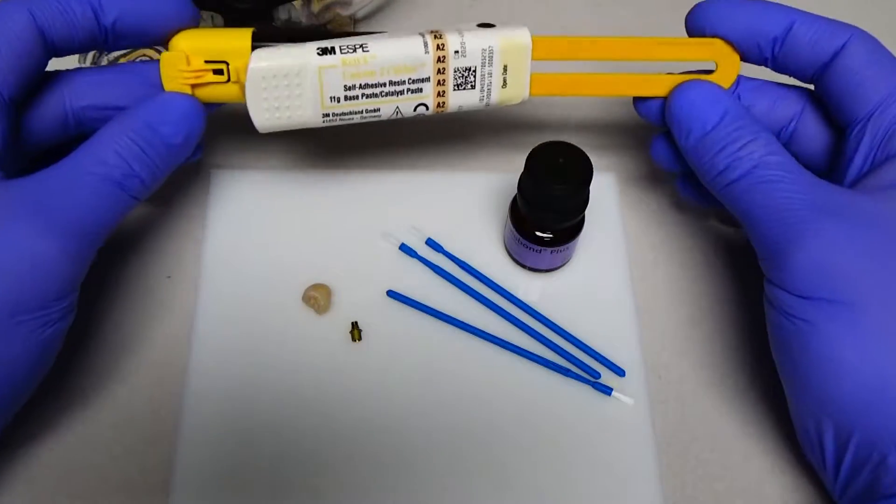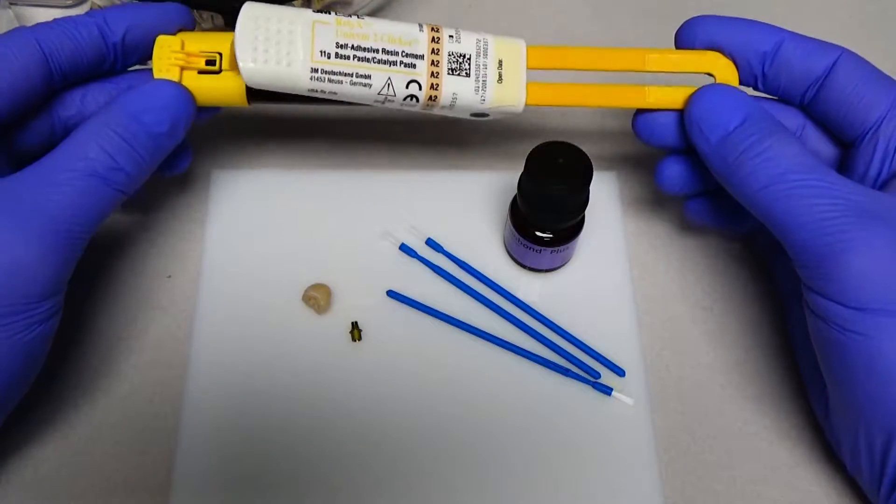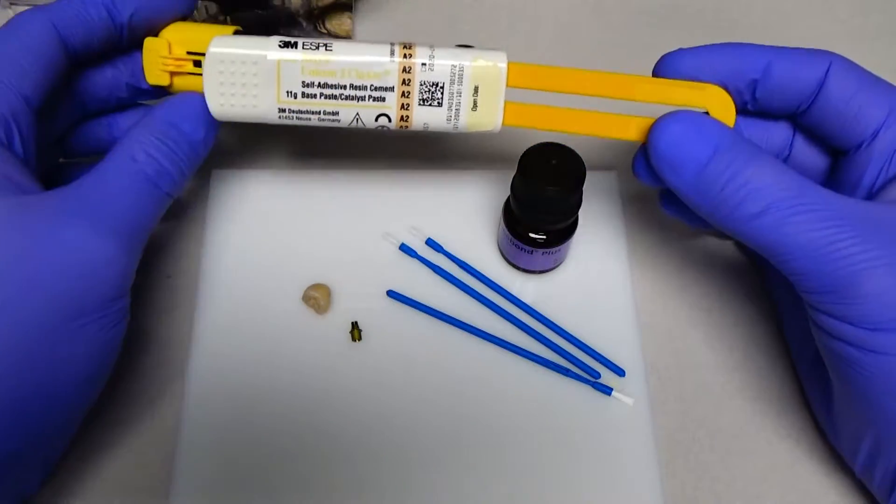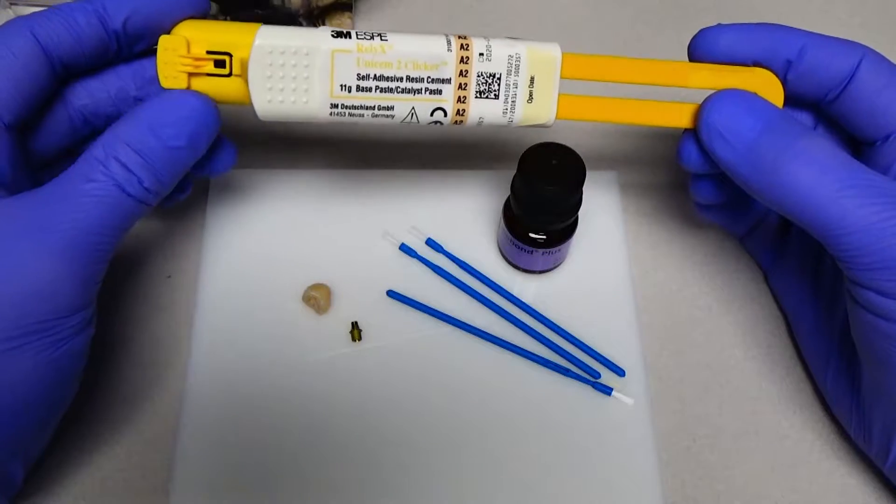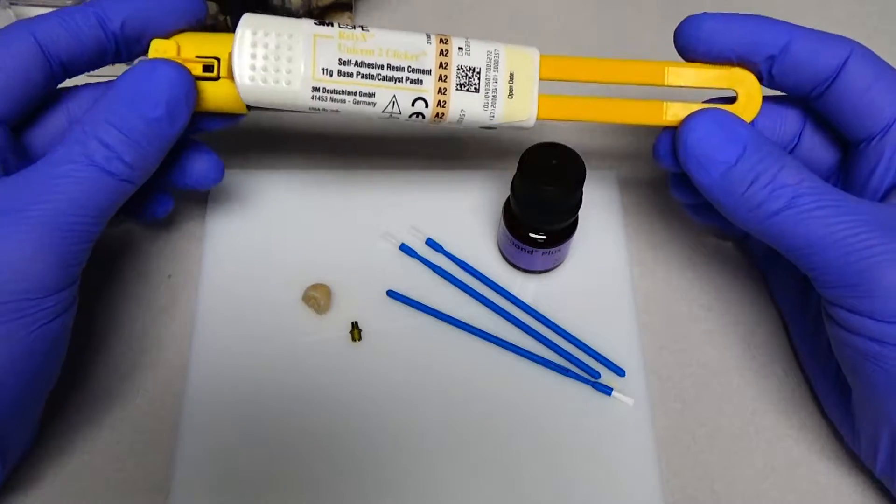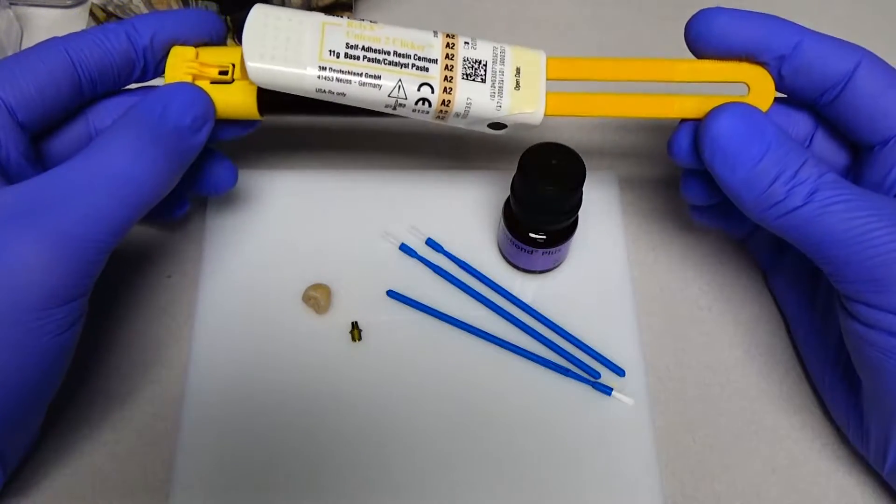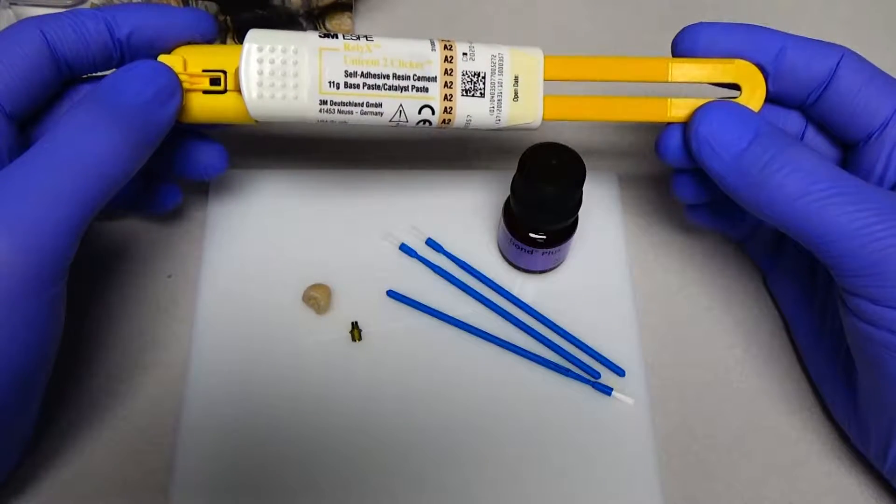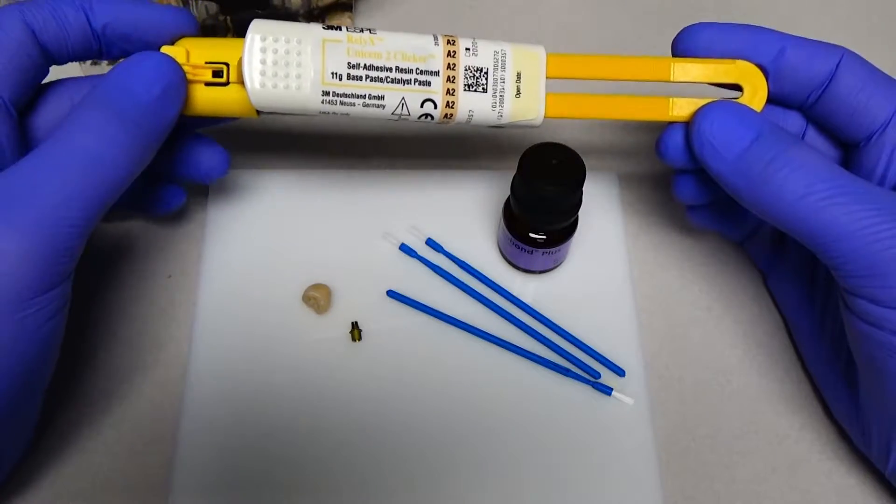And then the final thing, as far as bonding is concerned, we have our Reliax Unisem 2. And the Unisem 2 is important because the original Unisem doesn't have the MDP containing resin in it. But the Unisem 2 is actually rated for luting implant components together. There's various things from different manufacturers that you can use for this purpose.